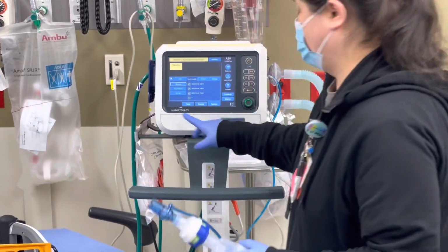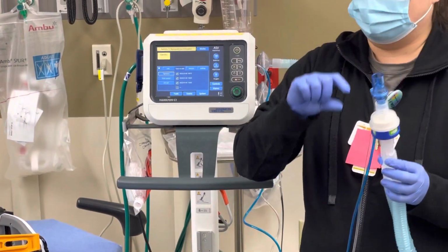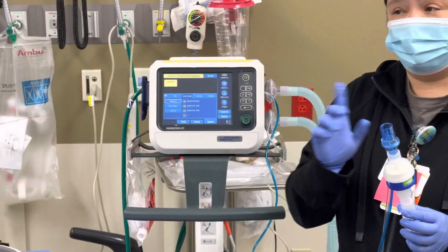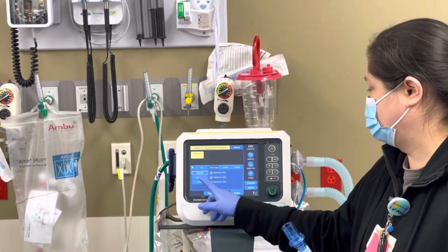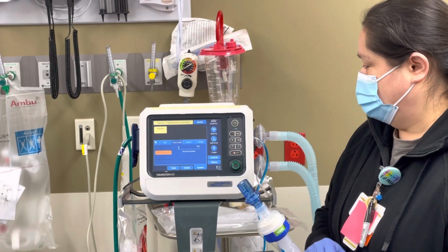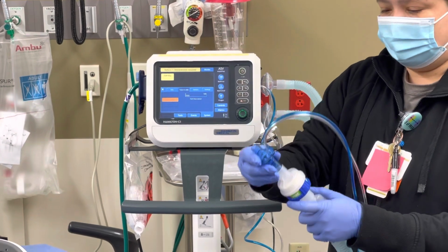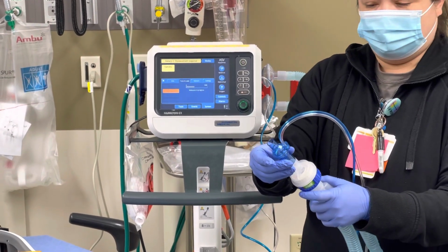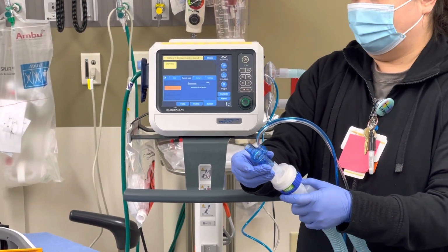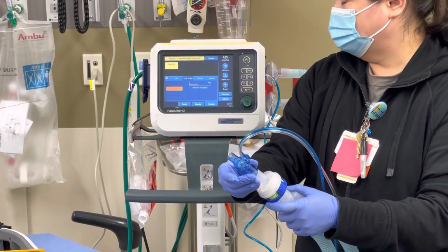Okay. So whenever you pull out your flow sensor, there's usually a little plastic cap. You can use that. It makes it a little bit easier, but if you don't have it, all you gotta do is just hold it still. So you hit your flow sensor, it'll tell you to disconnect your patient, and then it'll tell you to turn your flow sensor. All you're gonna do is just kind of match it up and turn it. And it's gonna run through the cycles of the flow. It's gonna start low and then it's gonna go high. And you'll hear it.